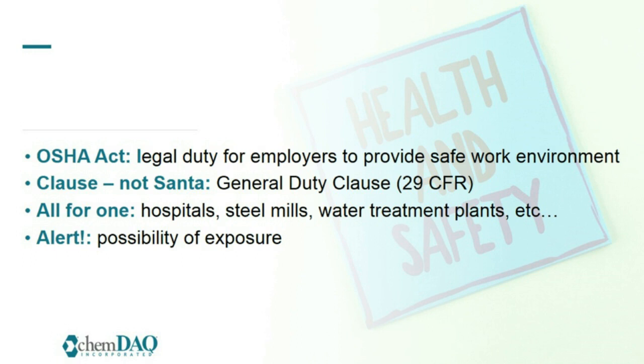29 CFR 1910.1000 provides maximum PELs or permissible exposure limits for specific compounds. For example, hydrogen peroxide is calculated at 1 part per million per 8-hour time weighted average. In 29 CFR 1910.1200, it says that it's intended to inform employees about the hazardous chemicals that they are using. HAZCOM, which refers to the signs that we see in the departments, involves labeling of chemicals, the use of safety data sheets, and especially training.